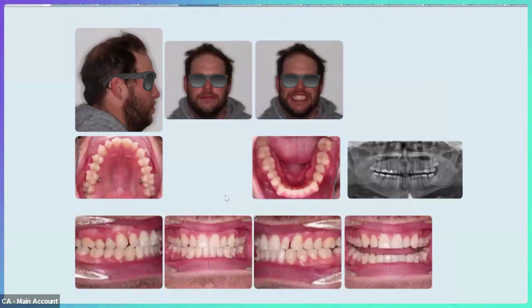One thing that I do a little bit maybe different than some, but I know a lot of doctors do it this way too. I don't wait on finishing the entire Invisalign case before we do the restorative. So in this situation, we've got better overjet and we've got the teeth set up in the proper position. At this point, we're going to go ahead and plan to do the restorative because I'm then going to ensure that the best restorative possible is done. And if we need a little bit more overjet, then we can go ahead and work on the correction of the teeth after the restorative is completed.